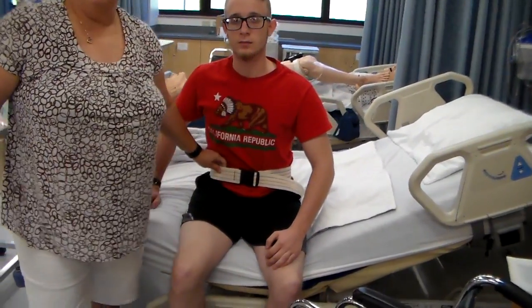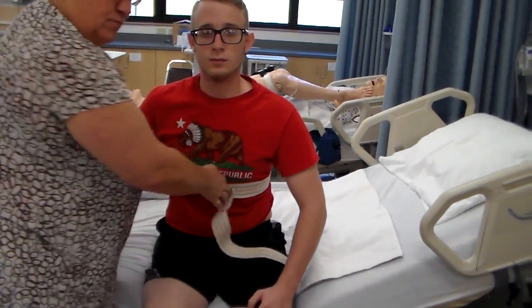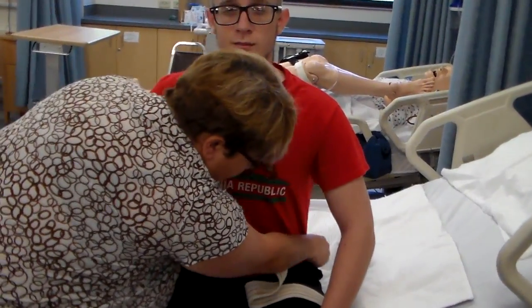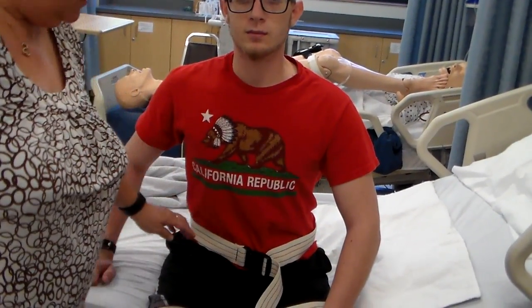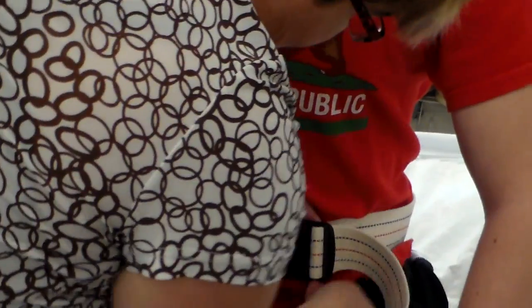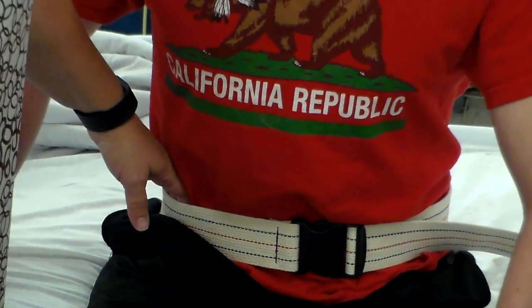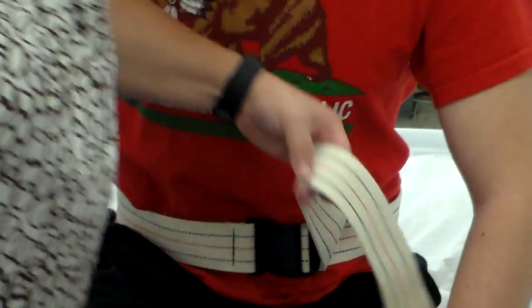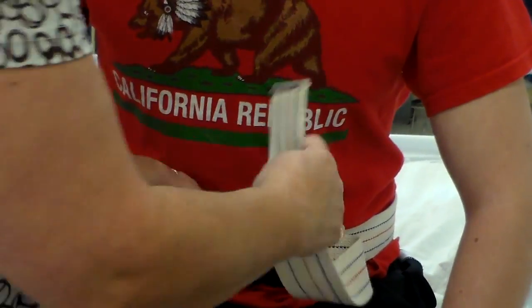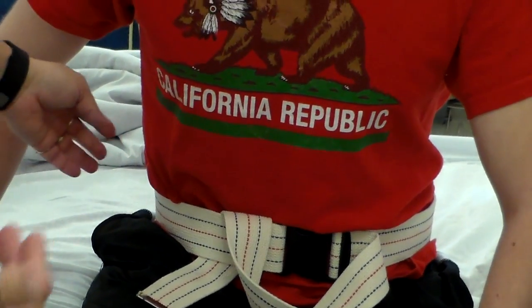Okay, we want to have this around the waist, not up here by the chest. We're going to put it down here by the waist. We want to have it snug. This might be actually a little too loose, so what do we do? Just tighten it. We want to be able to put our hands in here, but we don't want it so loose that it's just going to fly all over the place. Then you have this tail. Don't leave this just hanging around. You can tuck it down underneath, like this, in the front or the back, but you just want to have it snug.